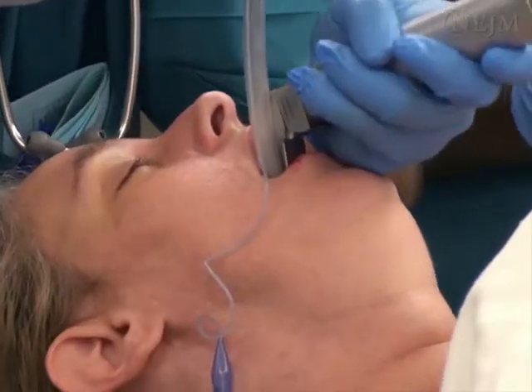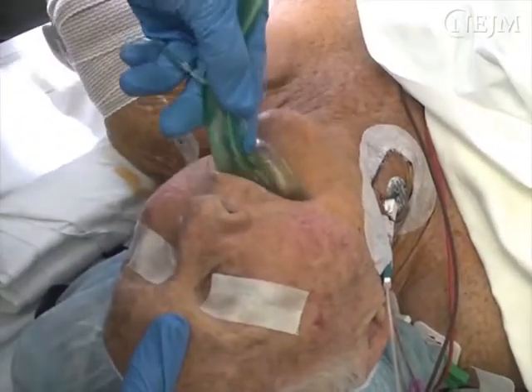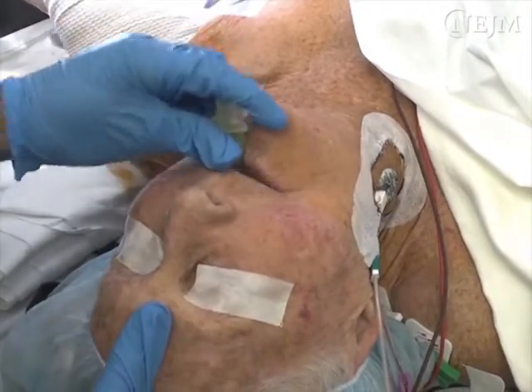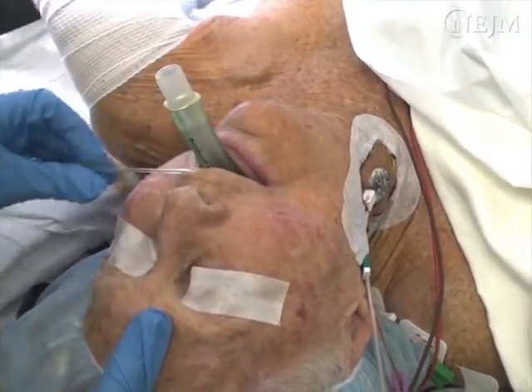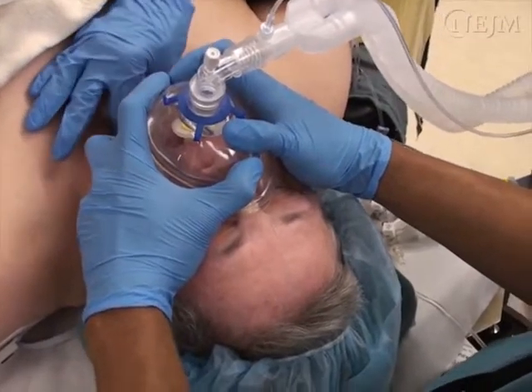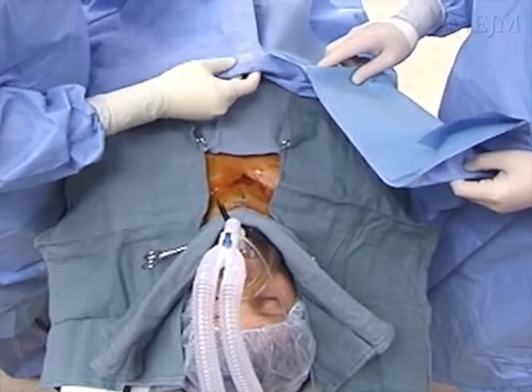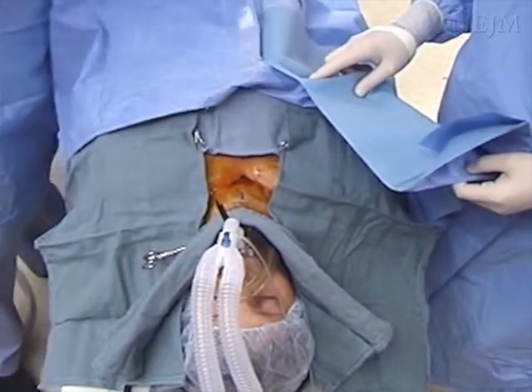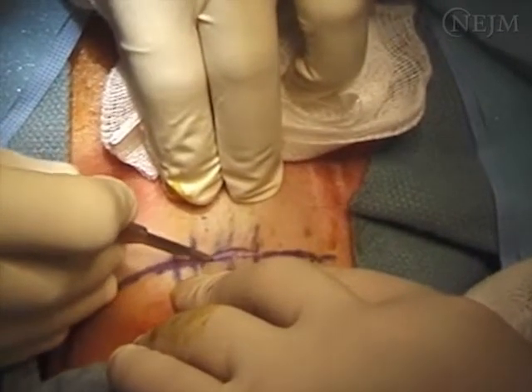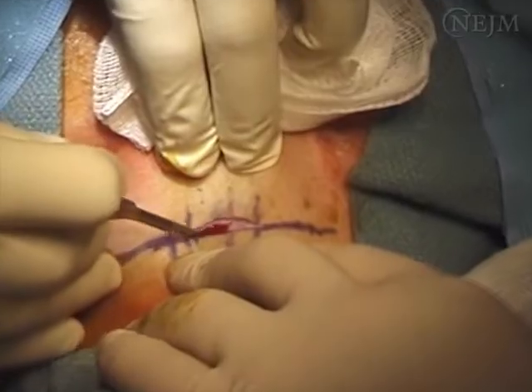If ventilation with a face mask or reintubation is difficult, a supraglottic rescue device, such as a laryngeal mask airway, may allow adequate oxygenation and ventilation. In the rare event that it is not possible to ventilate or reintubate the patient after extubation, it may be necessary to establish emergency airway access by performing a cricothyroidotomy. Thus, you should make sure that the equipment and personnel needed to perform a cricothyroidotomy are available.